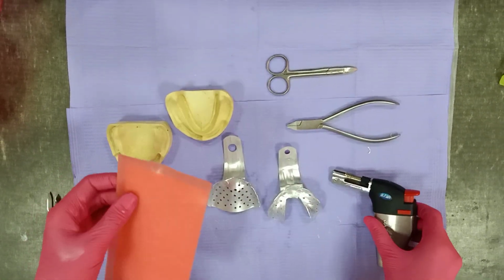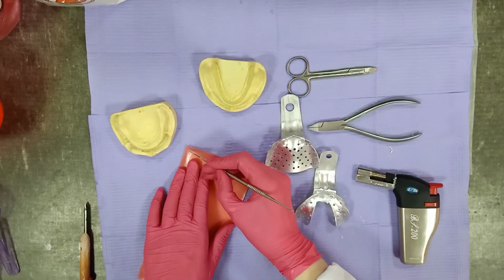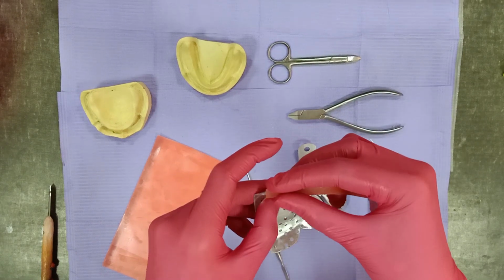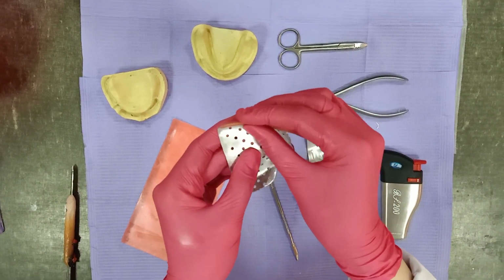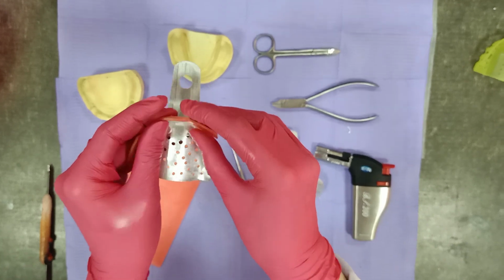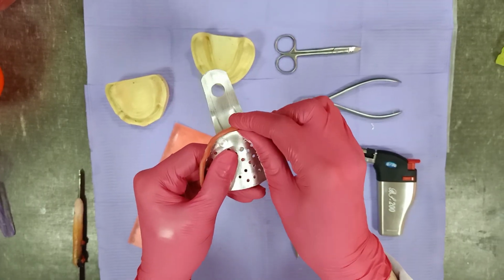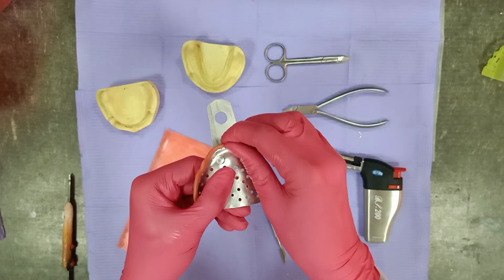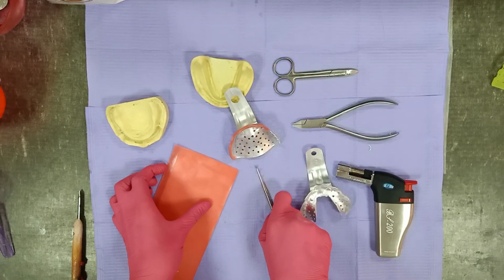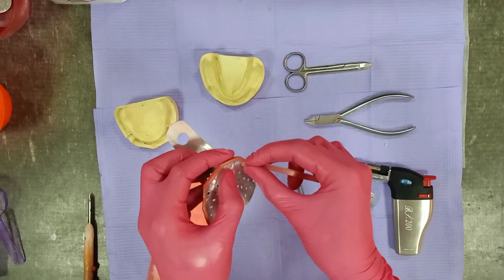We are going to use a torch and wax sheet to cover these sharp areas to make it smooth if we are going to use it in the patient's mouth. So a small strip of wax is going to be added all over the tray on all the borders, as you can see, so there will be no sharp areas present. We will make this in the upper and in the lower, and after doing this, we will retrim the wax in the patient's mouth, but as we have casts, we will not do this step.